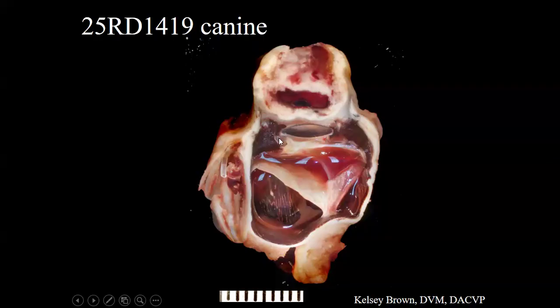The intraocular lens did seem to be anteriorly displaced. This globe is quite malformed, so sometimes it is hard to trust the placement of the lens, but in this case, it was broadly contacting the posterior cornea, which is not right. That should not be happening.